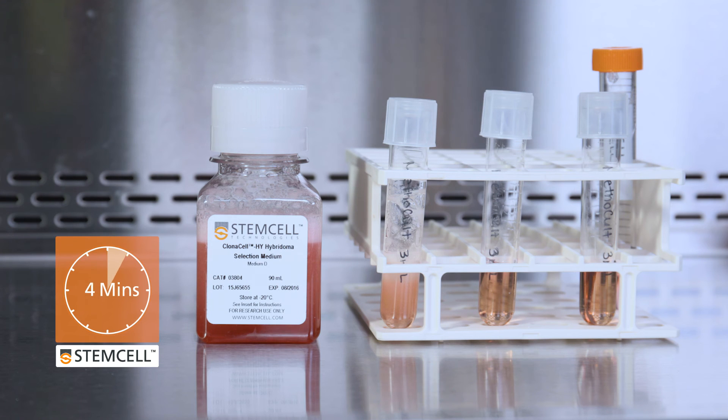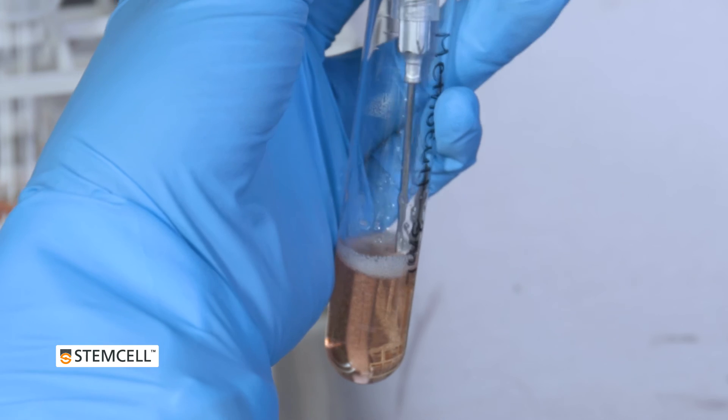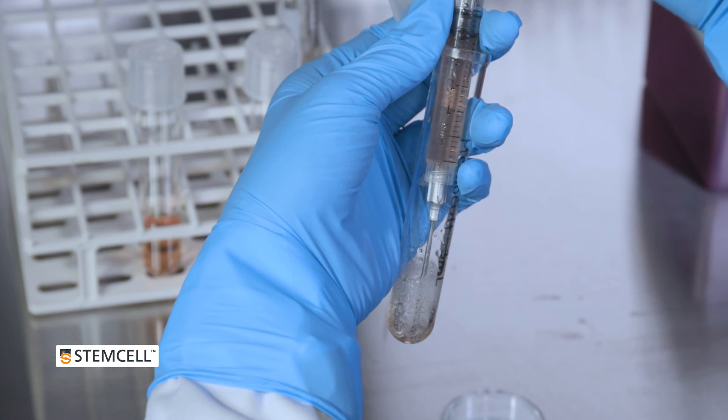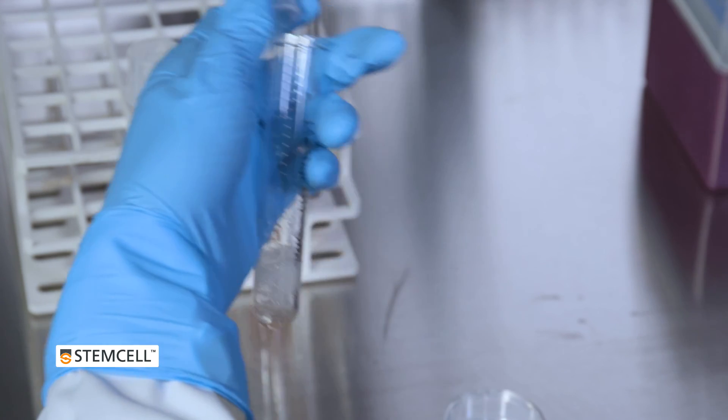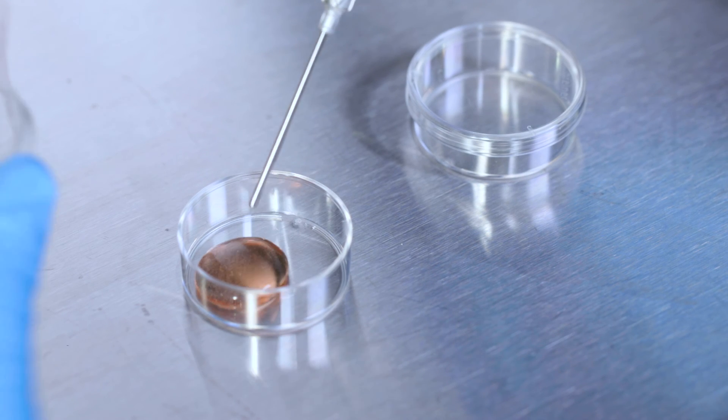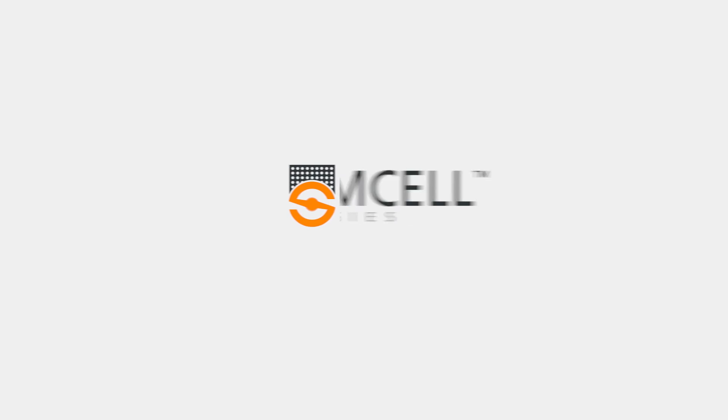Wait for the bubbles to dissipate, and then plate the sample using a blunt-end needle and syringe. If you have any questions about working with semi-solid methylcellulose medium, such as Methacult or Clonacel, please contact technical support.